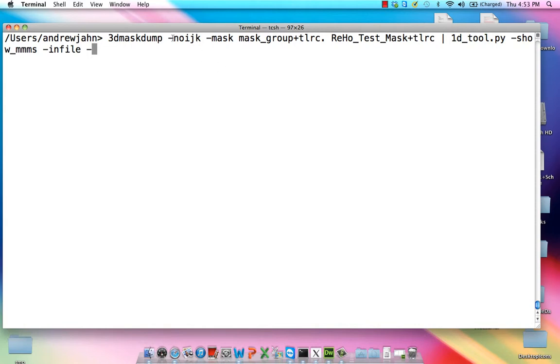I've included the options no IJK, don't want that information, using the group mask, the whole brain mask, and then taking for input the ReHo test mask that we calculated earlier.